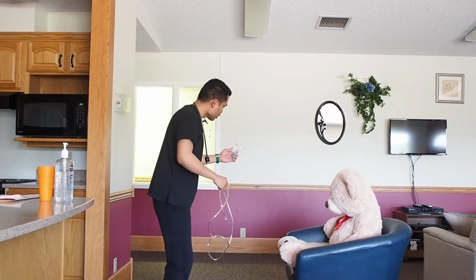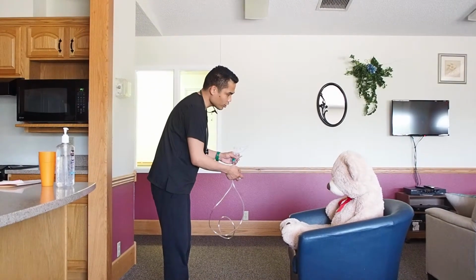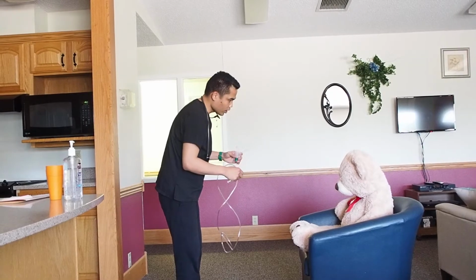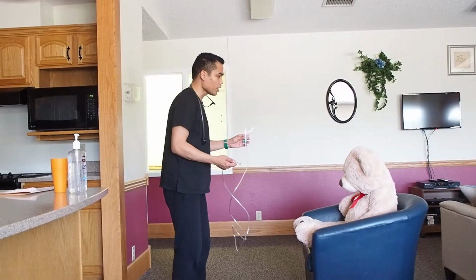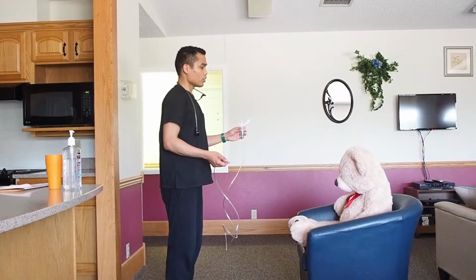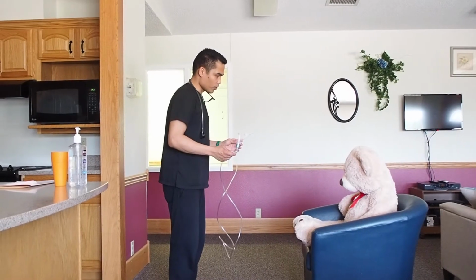And then you position this mouthpiece inside your mouth. And once you put it inside your mouth, you should position your tongue below. Please do not obstruct the mouthpiece. And then once we start, all you have to do is just do normal breaths. Try to observe me. Just relax with occasional deep breaths. Okay, so are we ready to perform it now?